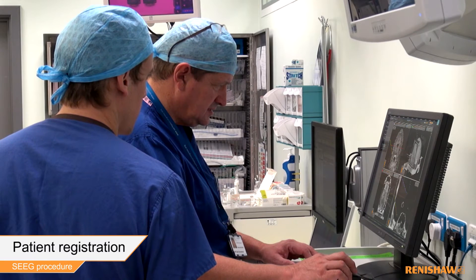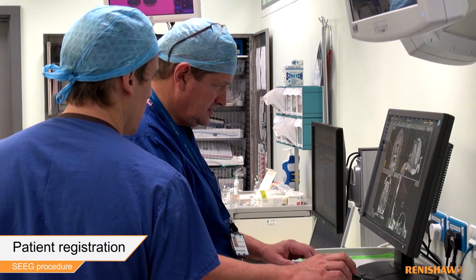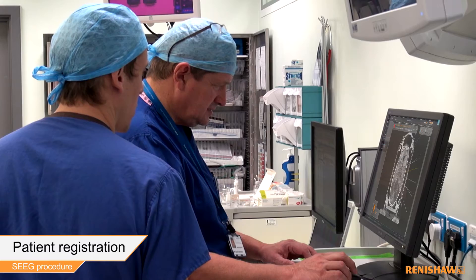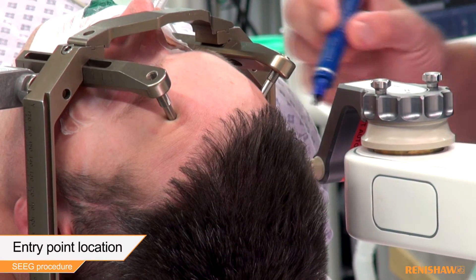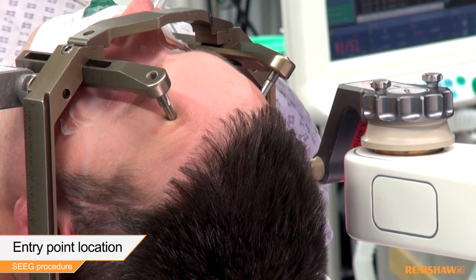Once back in the theatre, the surgeon registers the pre-op MRI with the pre-op CT data, which registers the patient to the Neuromate robot. The surgeon can now both identify and mark each entry point on the patient.